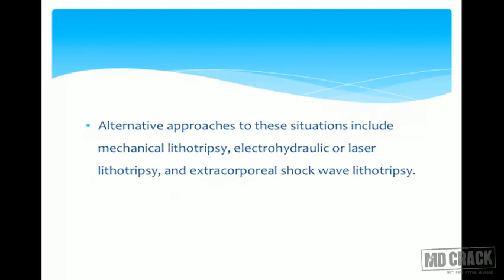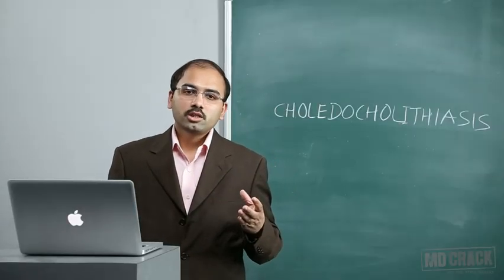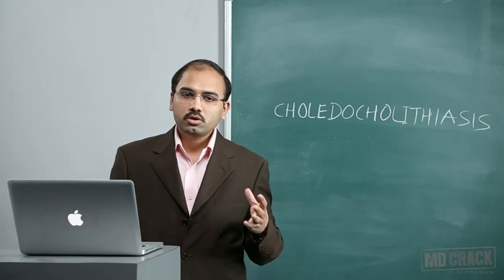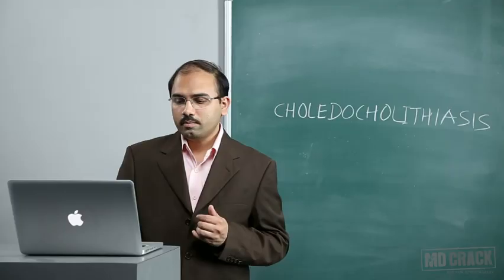Alternative approaches to these situations include mechanical lithotripsy, electrohydraulic or laser lithotripsy, and extracorporeal shockwave lithotripsy. So when you find difficult situations where the stones are larger in size, they may be crushed by external lithotripsy or mechanical lithotripsy to pulverize them, and they can then be extracted.